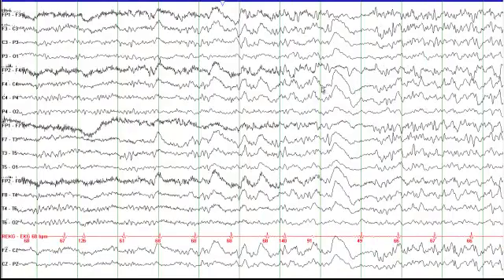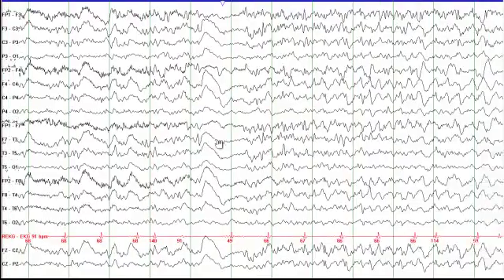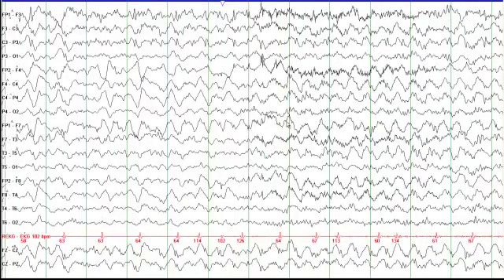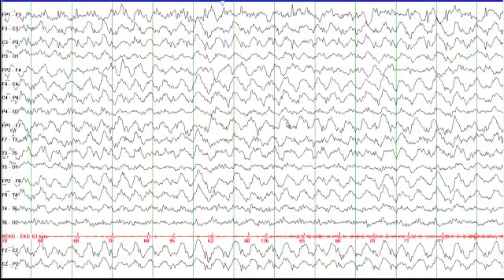Then that activity comes back again. There is generalized slowing, sharply contoured waves, delta frequency with superimposed beta frequencies. As we move over here, you can see an evolution: rhythmic delta and theta activity with sharply contoured waves and fast frequencies superimposed on the background that continues to evolve.